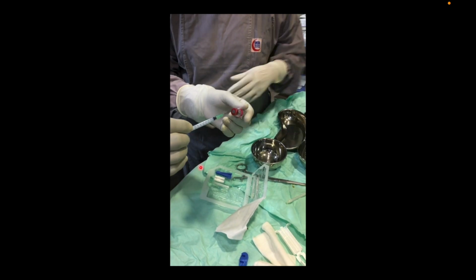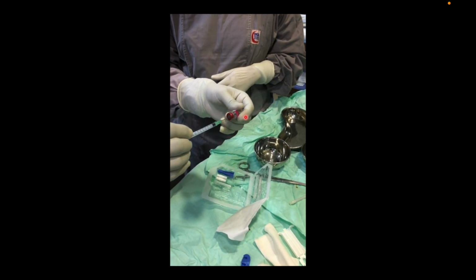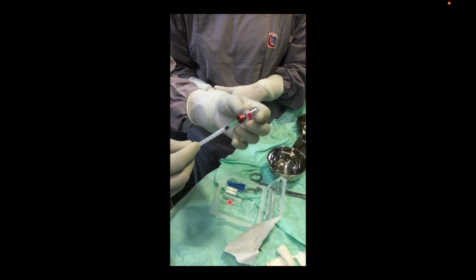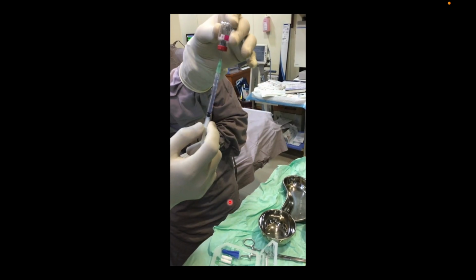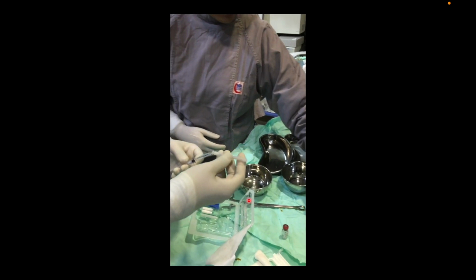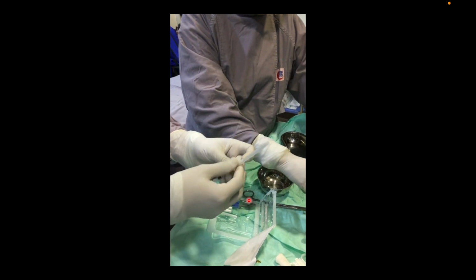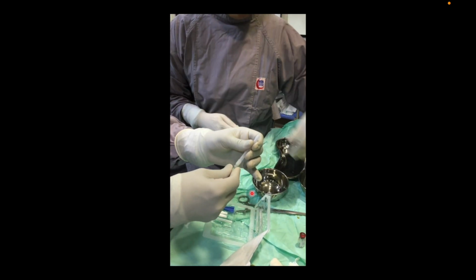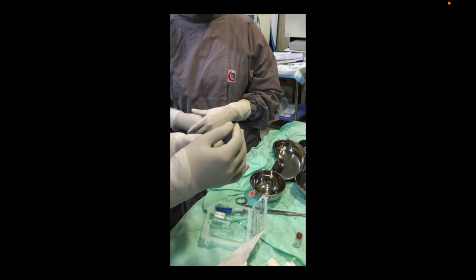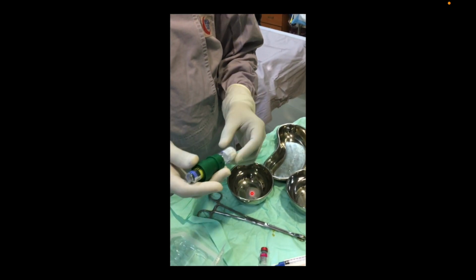This is one syringe. So for thrombin, which is red colored, there is a syringe which has red color on it. I'll show you that in a while, the colors. So with the syringe, you now draw this thrombin into this syringe and then you attach this long needle on it. This long needle also comes along with these bottles. So with this needle now, under ultrasound guidance, you can inject.